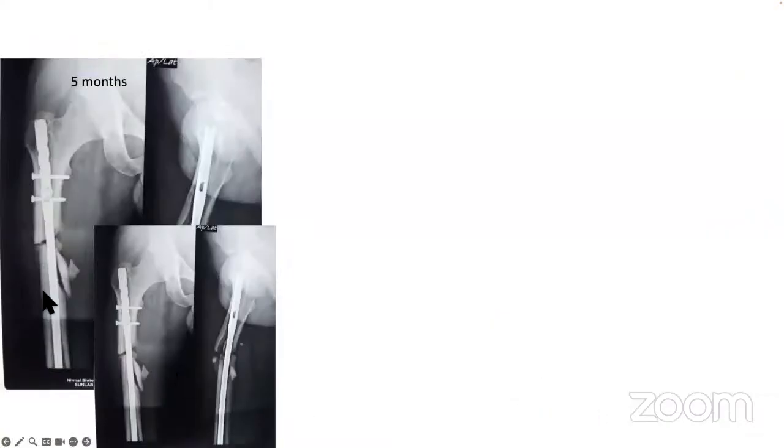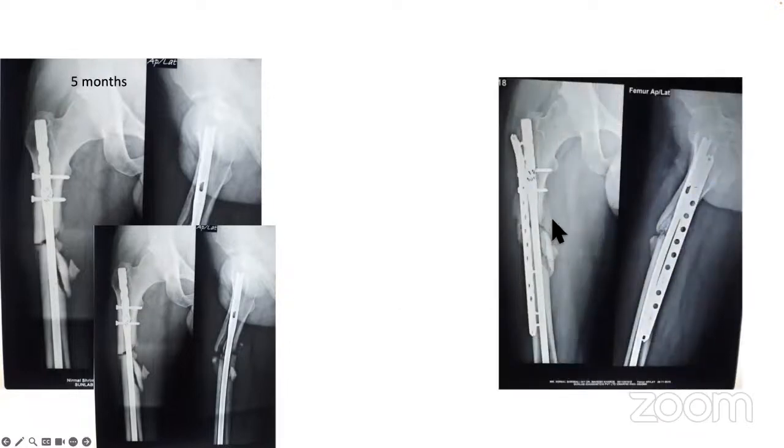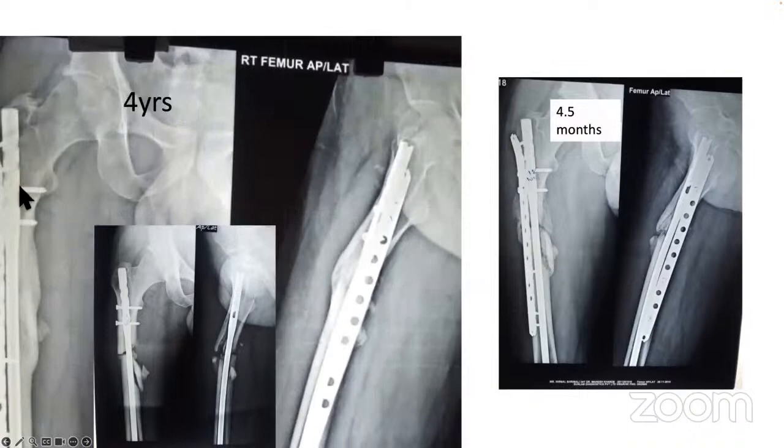This comminuted fracture, medially like this, with the nail passed, is not a stable construct. Even if you had passed the nail in the neck, it would not have been that stable a construct. If there was no comminution, this would have been a very good stable construct, no question about it. So this went through like this. Ultimately, it went into non-union, and that's the reason I put in the plate with graft, and ultimately it healed up beautifully. It took four years.